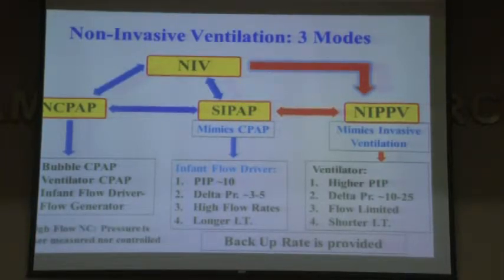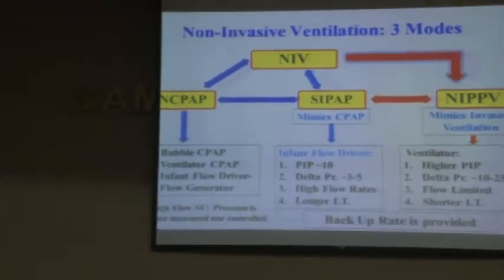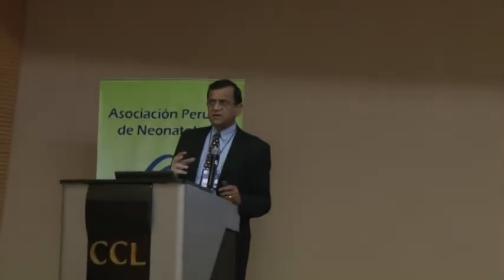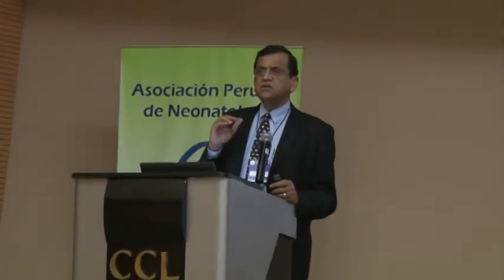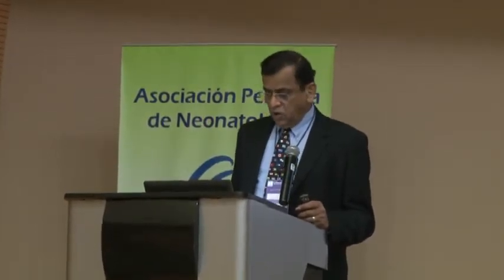I know many of you, or some of you at least, use high-flow nasal cannula. I do not allow high-flow nasal cannula in my NICUs because the pressure generated during high-flow nasal cannula is neither measured nor controlled by you. You have absolutely no idea how much pressure is generated. That's the reason we don't like to do that.